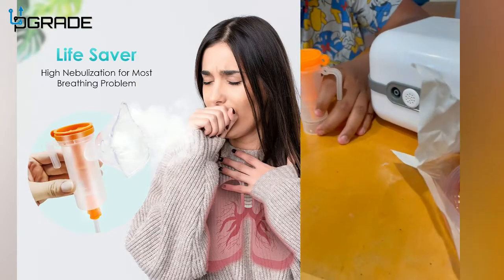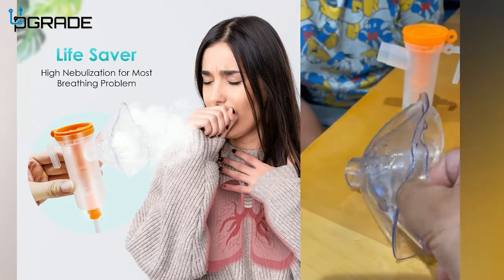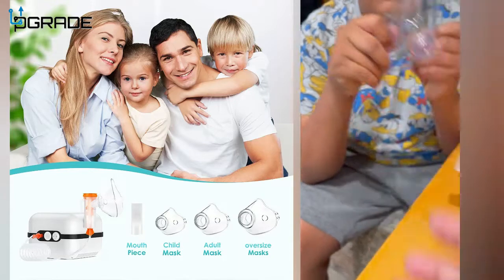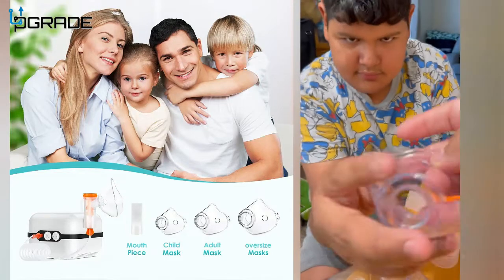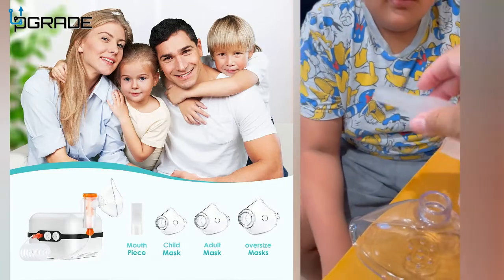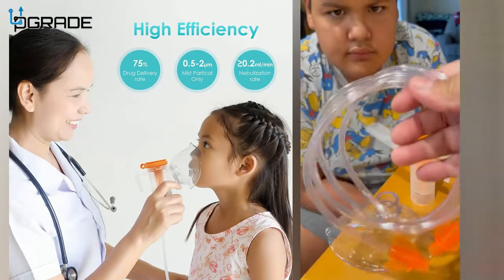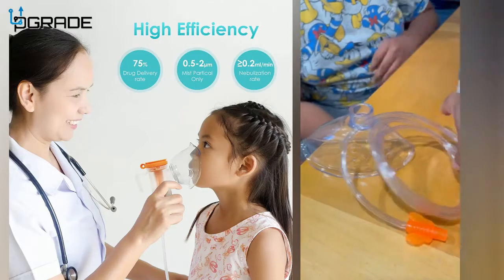Once the medicine is in, it has three sets of masks in three different sizes. There's a sideways one, a regular one, and a baby one. It also comes with a mouthpiece, which a lot of bigger kids prefer because they say the mask makes them feel uncomfortable sometimes. So you have the mask option and the mouthpiece option — they're very helpful.